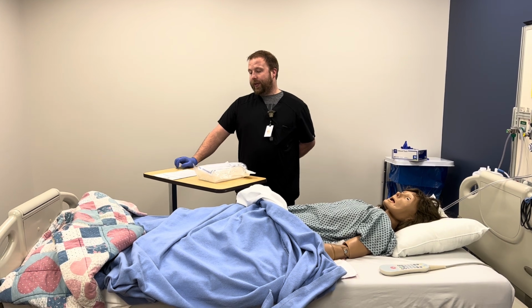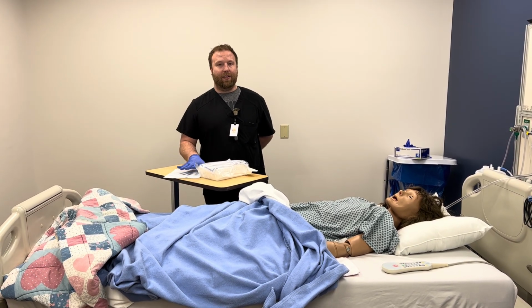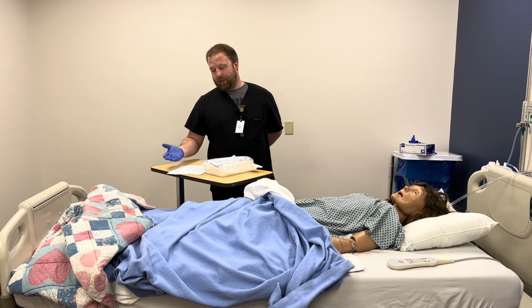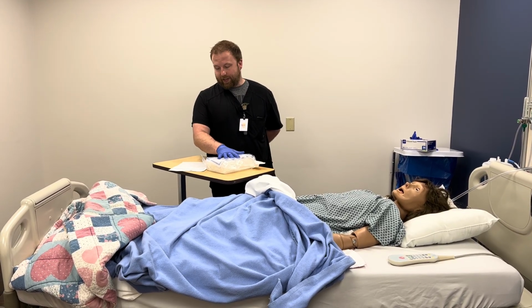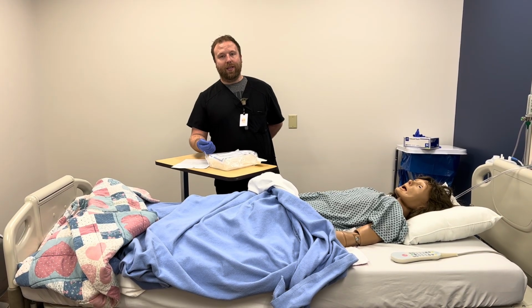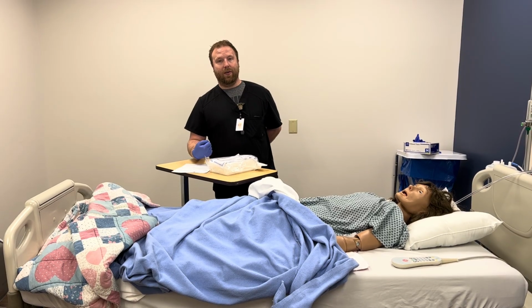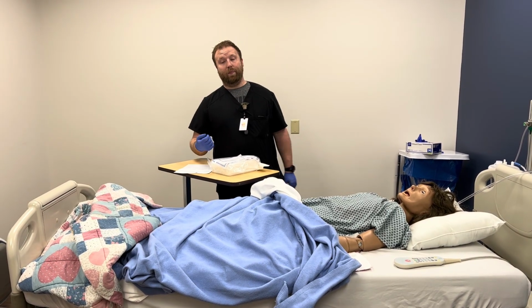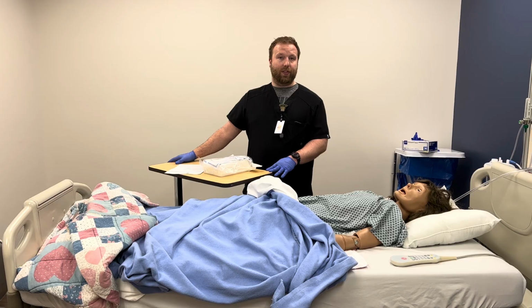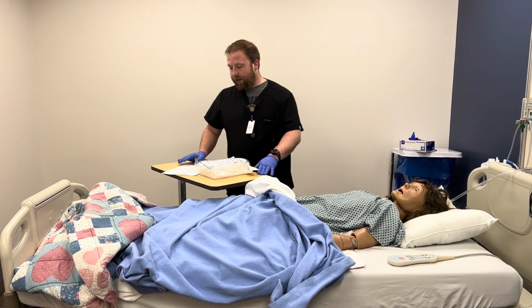What is the difference between indwelling and a straight catheter? Indwelling is exactly what it says. It stays in there, it indwells inside the bladder. It's a tube, and that's what we'll be placing today, an indwelling. A straight catheter is something that's temporary. You put it in, empty the bladder, and then you take it out. Some patients will do this at home by themselves, and in an ER setting, we will do this for confused patients that are incontinent and we need a urine sample.